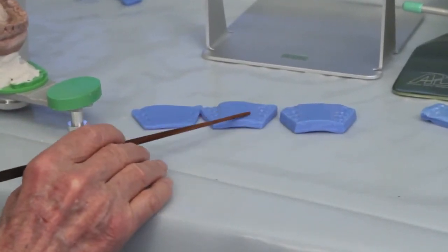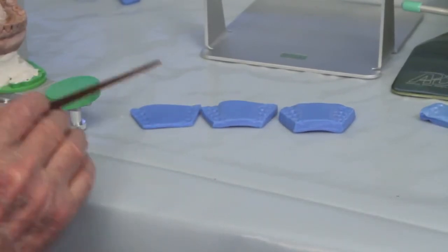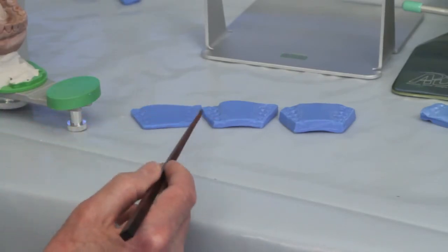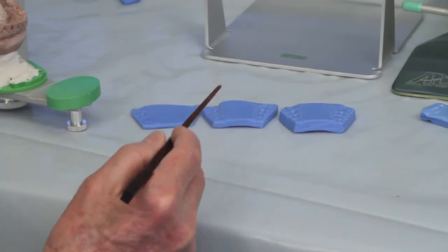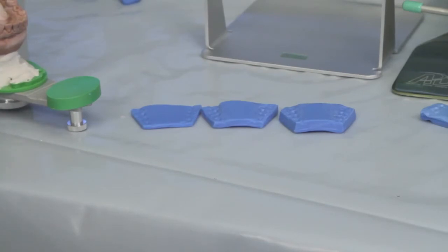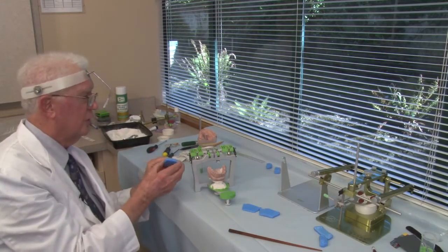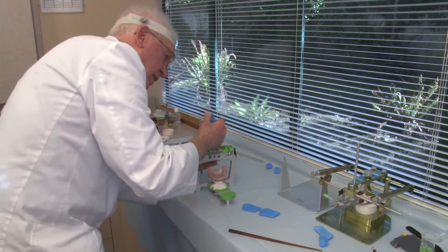So if all three of these split cast check, then that means that my mounting I did with a power centric bite is accurate. That means that I captured the arc of closure of the mandible and I transferred the axis correctly. So this is a very important step to check the accuracy of my mounting, because I will use this mounting then to make all my treatment decisions on the patient, so you want it to be accurate. I'm going to use the thick one first. So this is three thicknesses of wax. It means the mandible is open more.